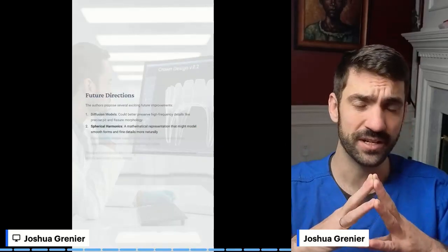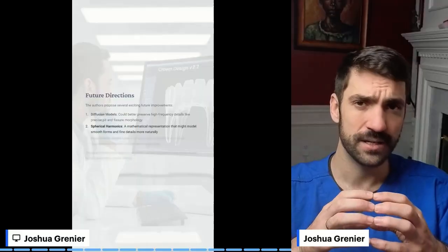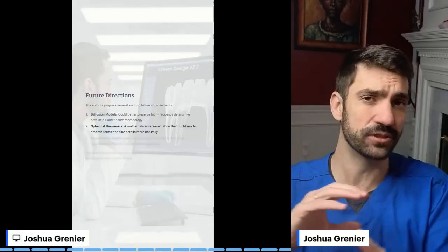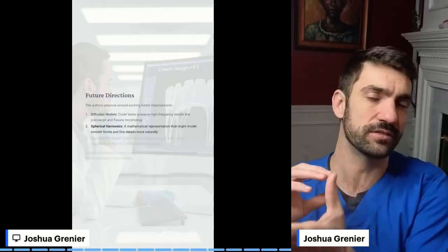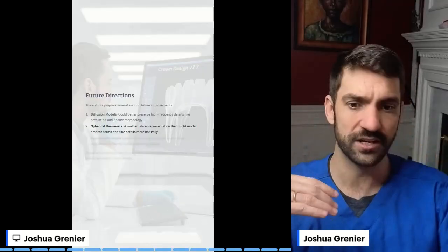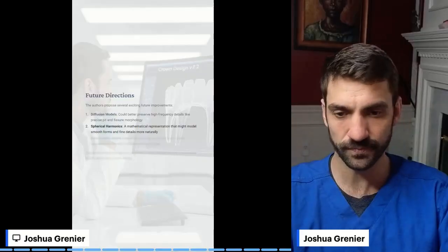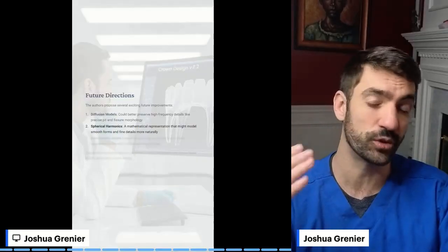They talked about various ways to simplify. These point clouds are incredibly complicated. Same with meshes. It's just difficult for computers to deal with. But if you were able to convert that into a predictable shape, and they talked about using harmonics to actually do that, and then you could create a shape, which you could then use something like a Fourier transform.